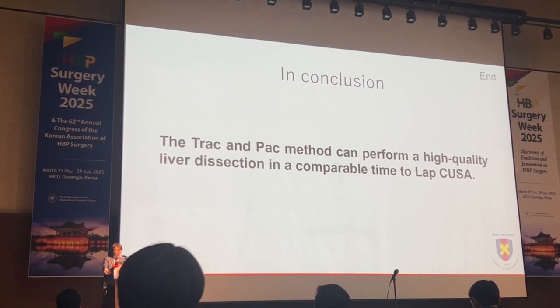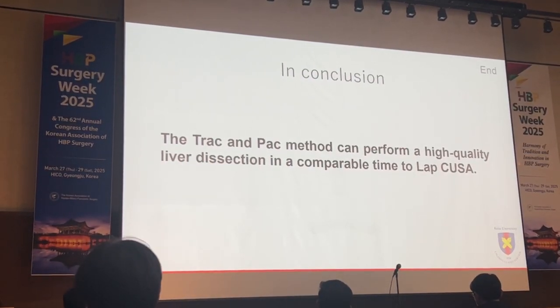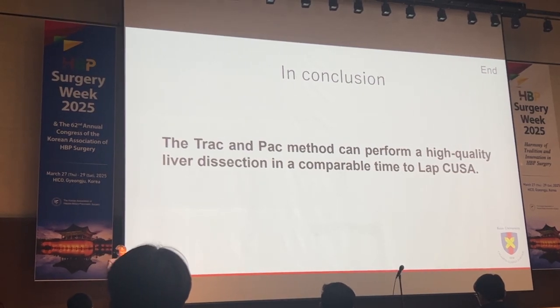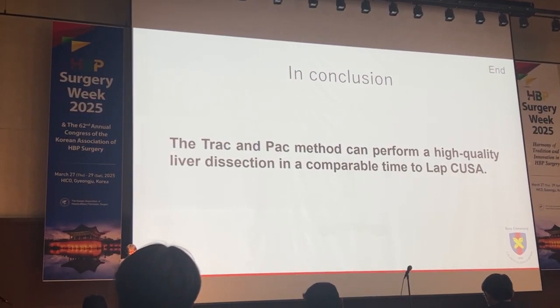So in conclusion, we introduced a Trac and Pac method that can perform high-quality liver resection in comparable time to lap CUSA. Thank you for your attention.